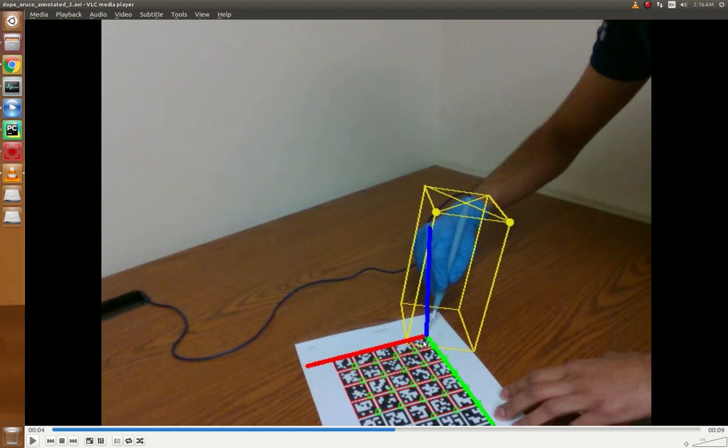Now if I compare the ground truth location, which is this one, and the tip's predicted location, which is in this case probably somewhere in here, then I can calculate how accurately I am guessing the tip's location.